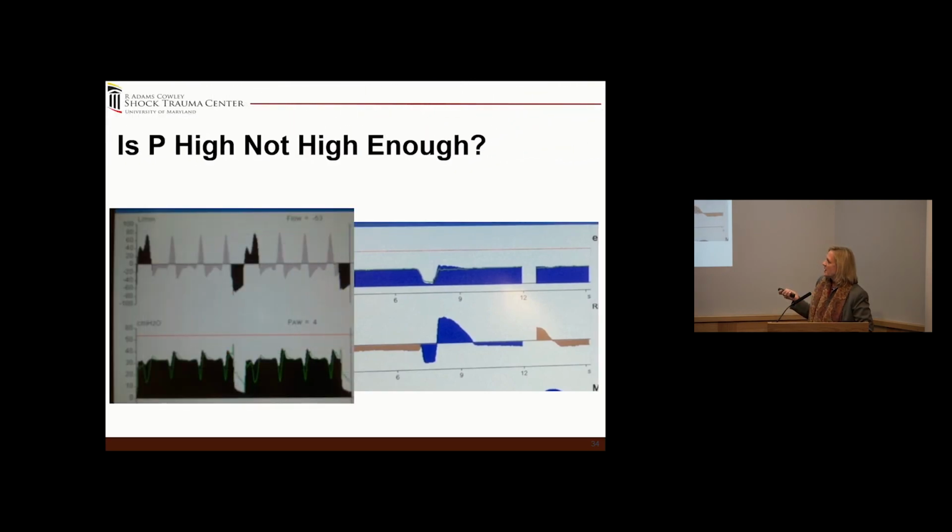If you can look here, this airway pressure, this is where it's good to be short and wide. Tall and skinny is not good. And you can see that this patient cannot even take a breath. They can't sustain that breath. And you can see also it is in excess of the machine flow volume. Flow characteristics. This is the machine here. This is the patient actually pulling through the machine breath. So the machine flow is 40 liters, where the patient is about 80 liters. So that's a patient really pulling. So you might want to consider that that airway pressure might not be high enough.